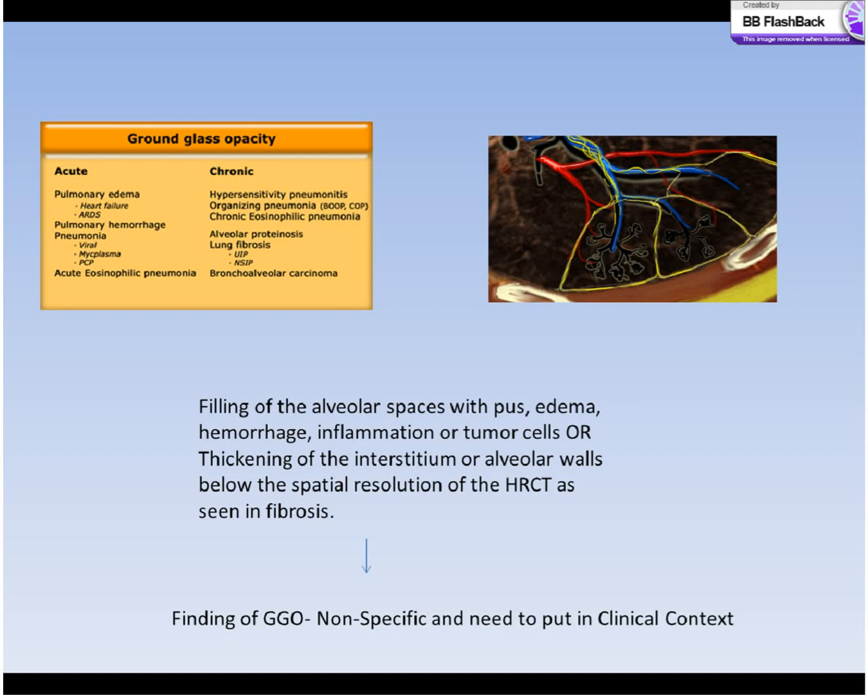Chronic changes, any airway distributed process such as hypersensitivity pneumonitis, whereby again you have an antigen that you're inhaling. It can cause an intense inflammatory immunological response in the lung but in the secondary lobule, and you can get similar findings of ground glass opacity. Other chronic ground glass opacities would be alveolar proteinosis and bronchoalveolar carcinoma.